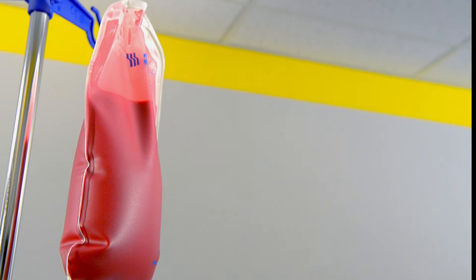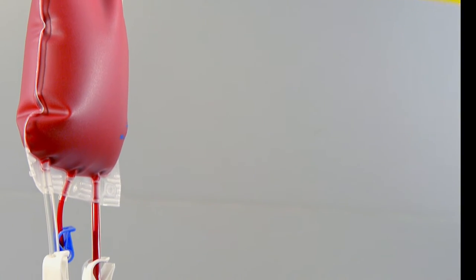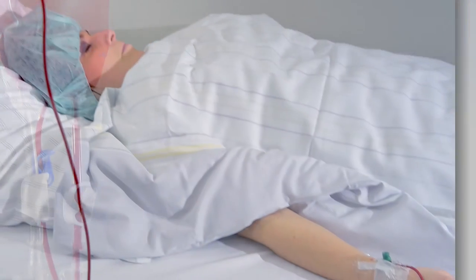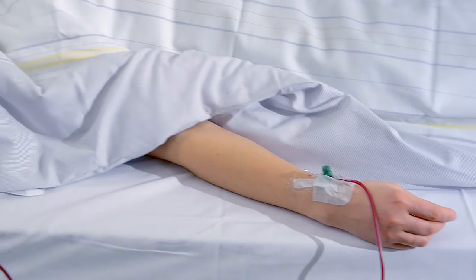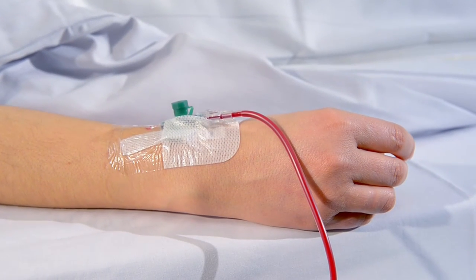Use the caps to close the ports to avoid leakage. Hang the disconnected PRC bag from the AT3 set over an IV pole and connect it to the patient. Packed red cells are ready for reinfusion.